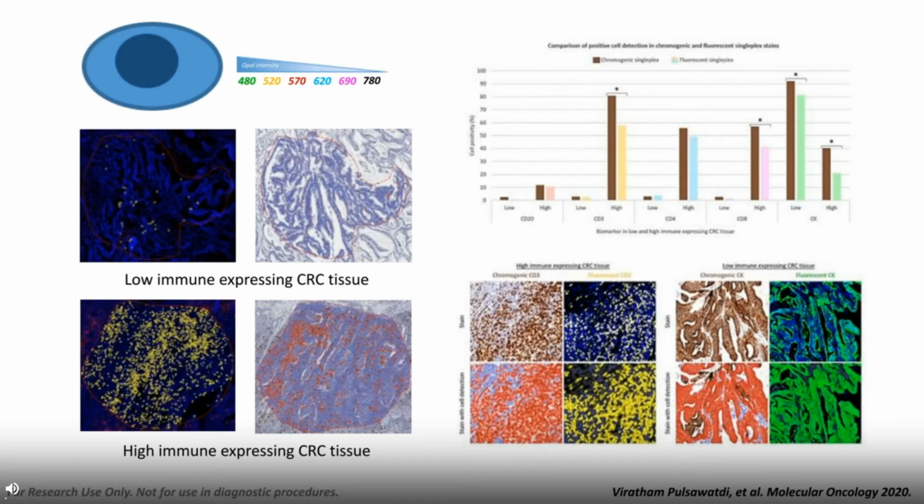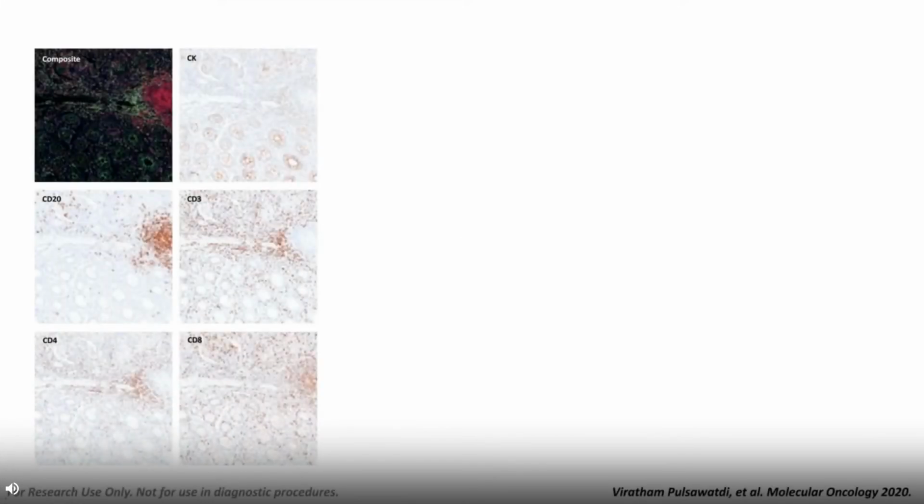So this gives us an idea of the antibody order we need to apply, and also how we pair our Opal dyes up for the multiplex panels, and allows us to do our first round of multiplex staining on our system. So after doing our staining process, we were then able to review how well our multiplex designs worked.